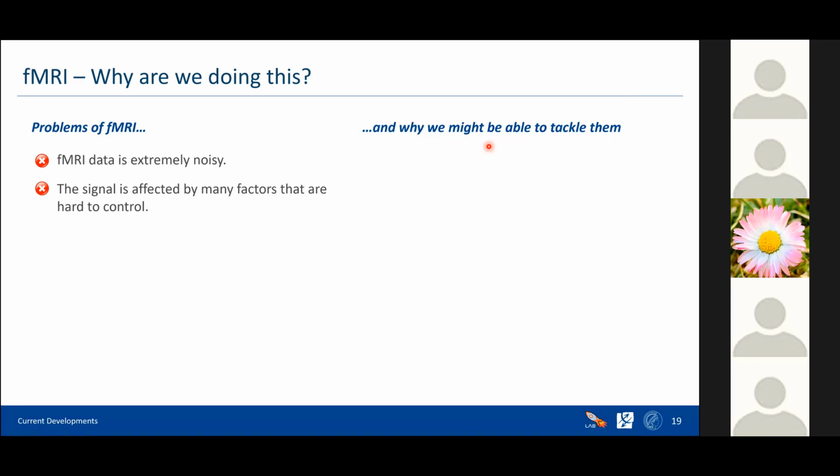What you actually see in these images is the blood oxygenation, basically. And this not only changes because of something that is going on inside the brain, but also might be affected by other factors. Did the patient drink a coffee before he went to the scanner? Or whatever, is she tired or not? There are super many factors that are really hard to control. And of course, this makes things hard to reproduce.